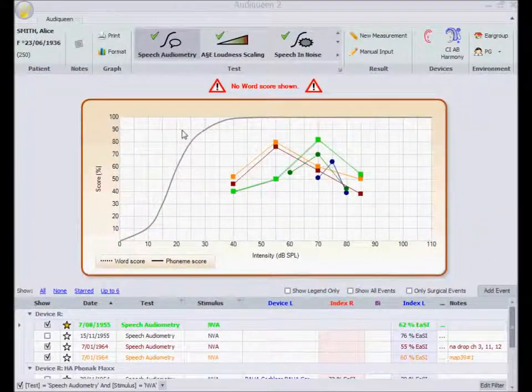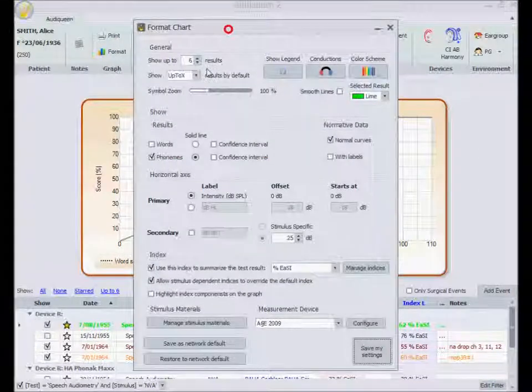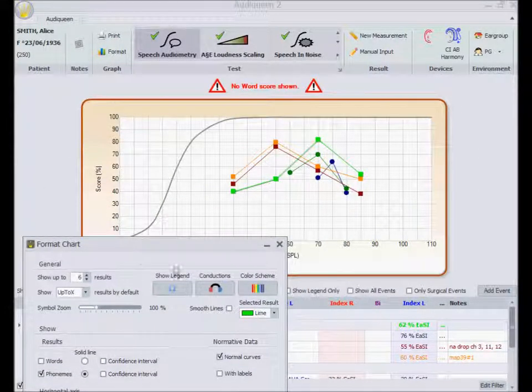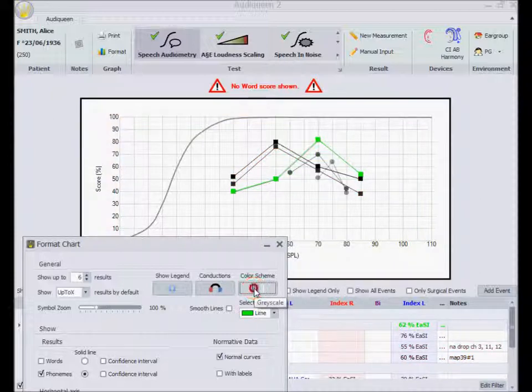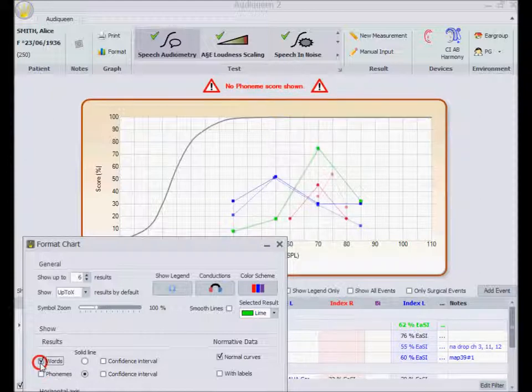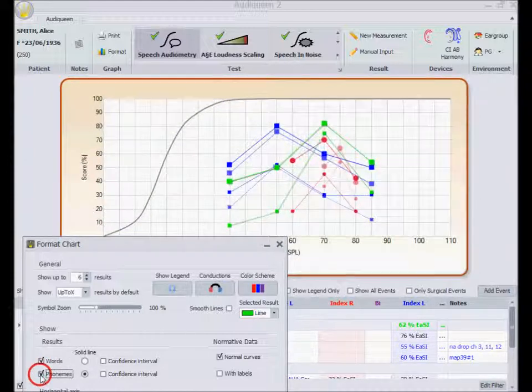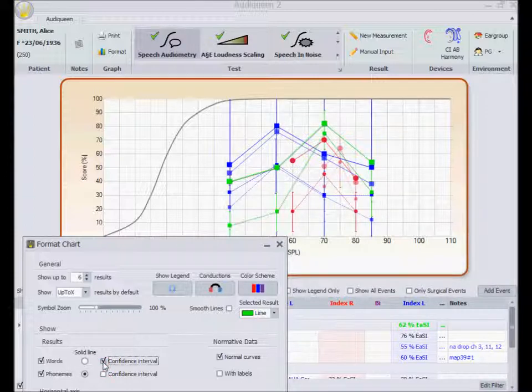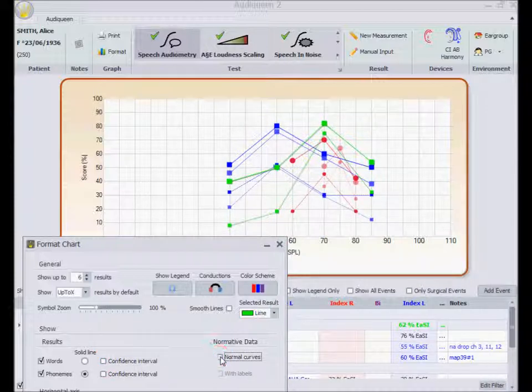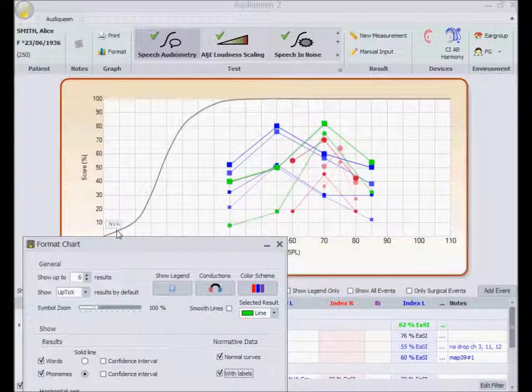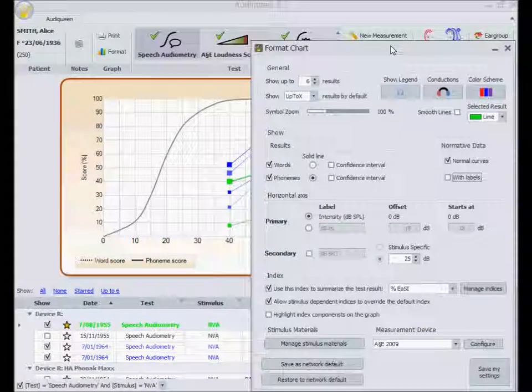In speech audiometry, I can also change the color scheme. Or I can select whether to display the word score, or the phoneme score, or both. Whether to display the confidence intervals. The changes are immediately implemented on the graph. I can decide whether to show the normal reference curves, with a label or without.